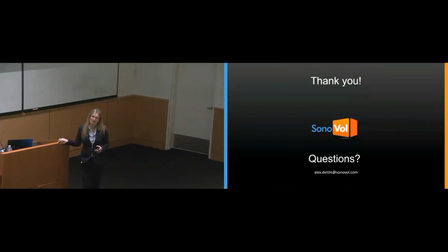Yeah, you can. Like the way you position for the heart, the sternum will also interfere and may shadow the right ventricle. So that's more challenging than imaging the left ventricle. And I think Maria can probably give some more information on that. But that's where positional effects do matter to a certain extent.